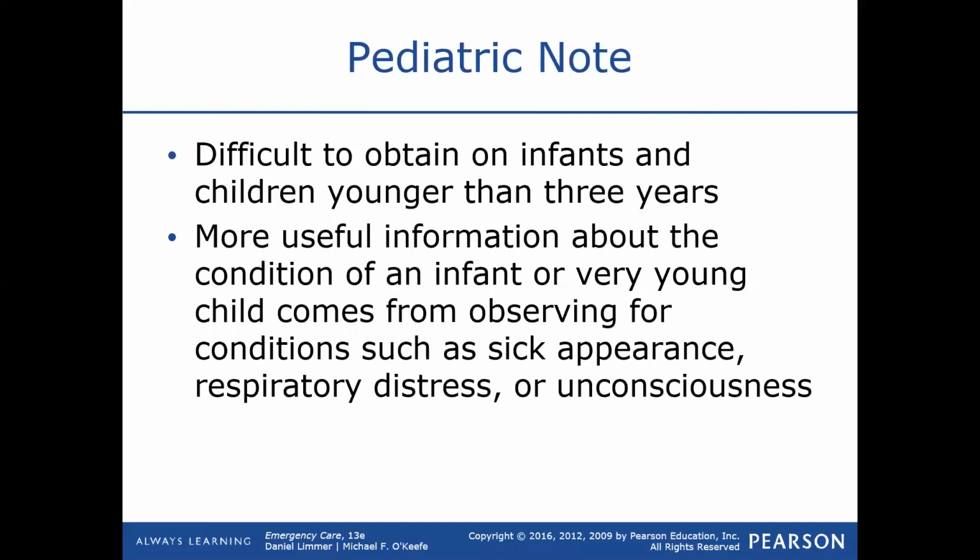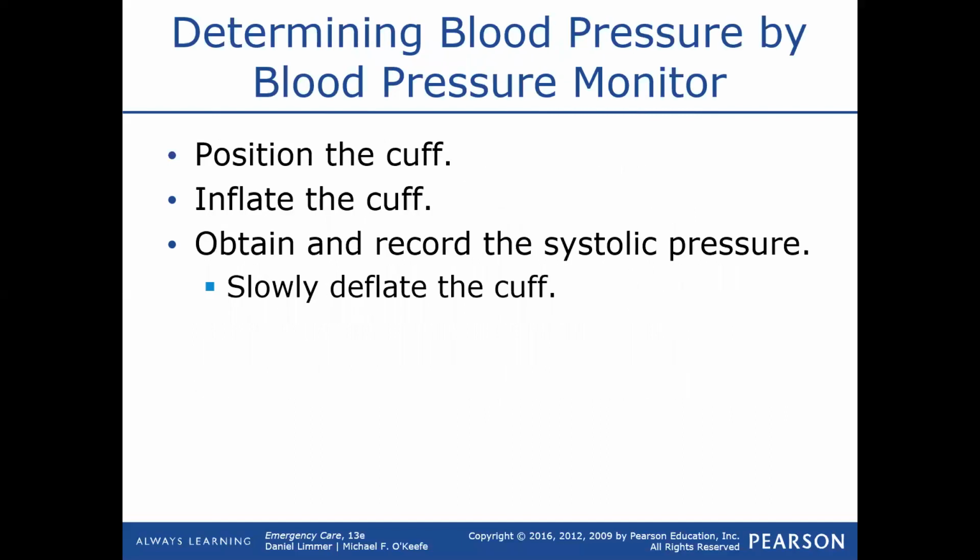So if you have an infant, if you have time, you can try. You can get it on their leg. It's not easy to do with a stethoscope. I would just say don't even worry about it. Some of the machines, the LifePaks and stuff, they'll wrap it around the child's thigh, and it can get a blood pressure, but it's not easy to do manually.